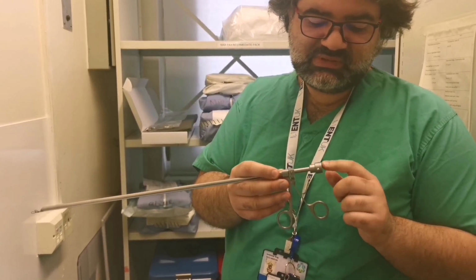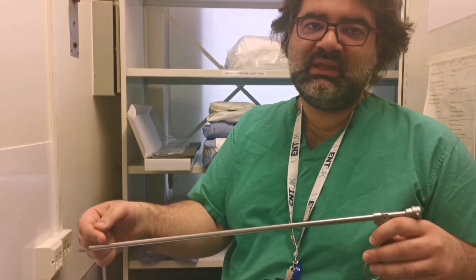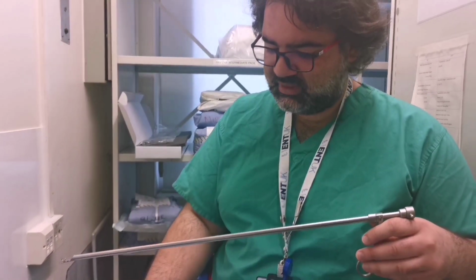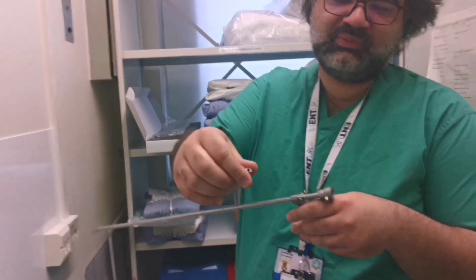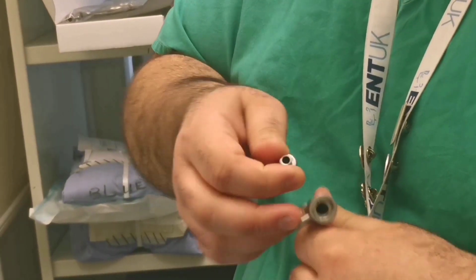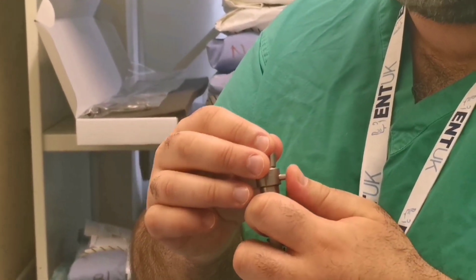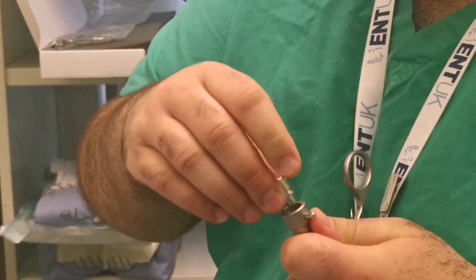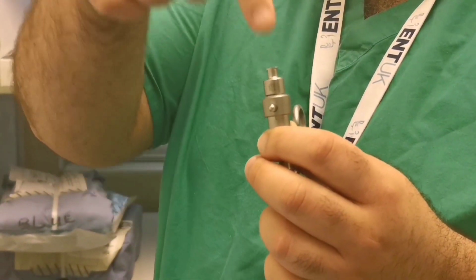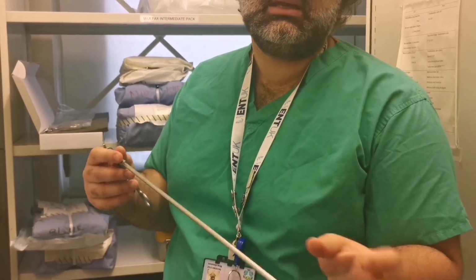For our optical forceps, if the lumen gets some tissue inside and we need to clean the lens or the pathway where the lens runs, or if we need to do some flushing, there is a cleaning adapter that can be attached to the forceps. It goes in this direction. This needs to be open, this goes in this direction, and again, as usual, we have to lock it in this direction, and then we can use it afterwards for flushing. Once it's locked, so it doesn't come out, we can put a syringe and flush this area if we need to clean it.